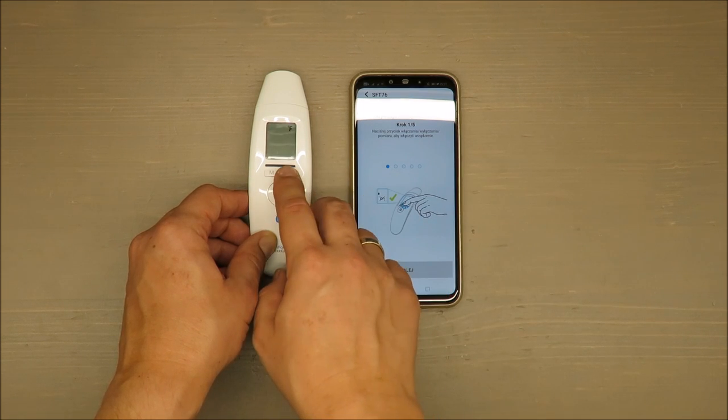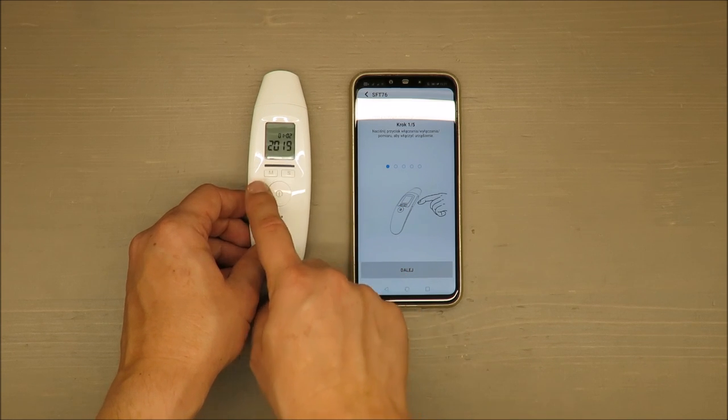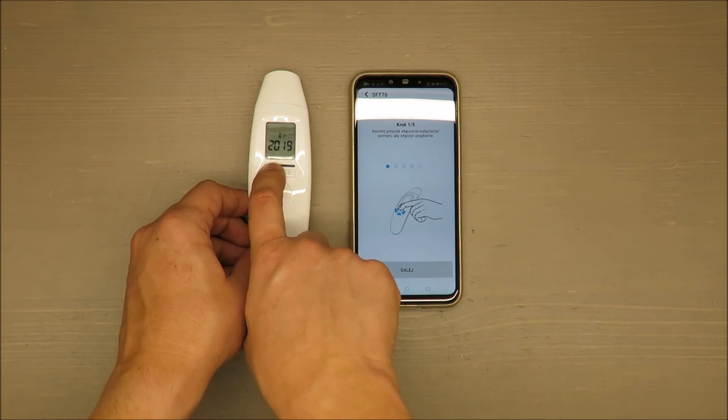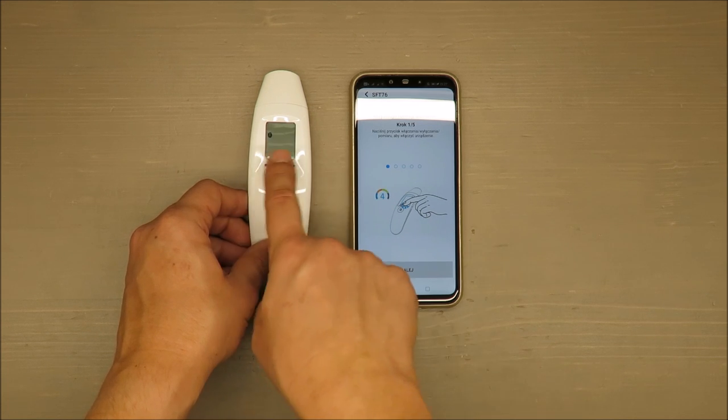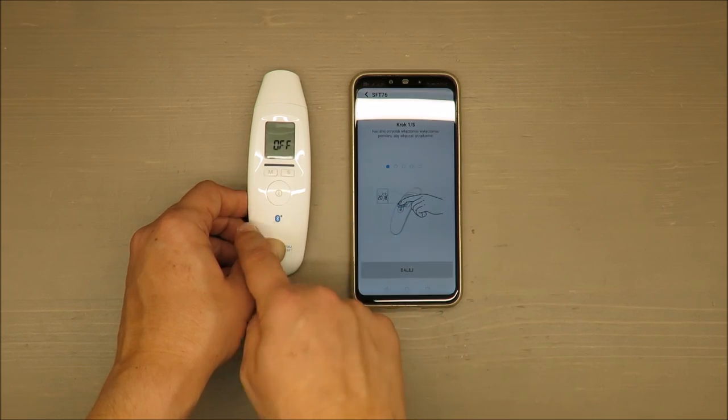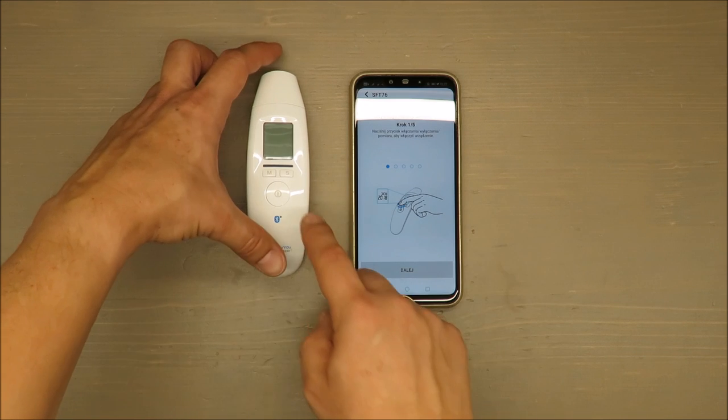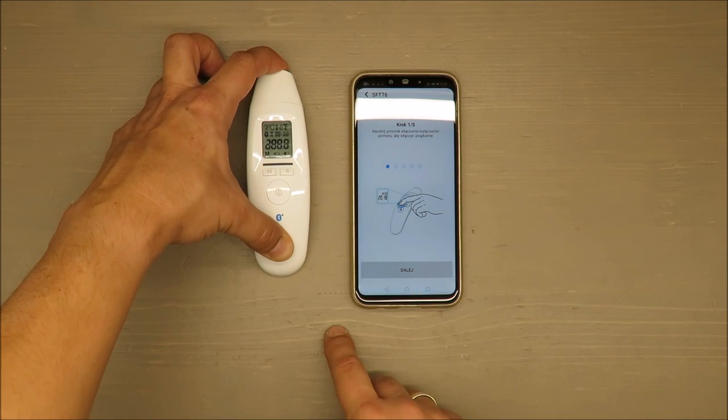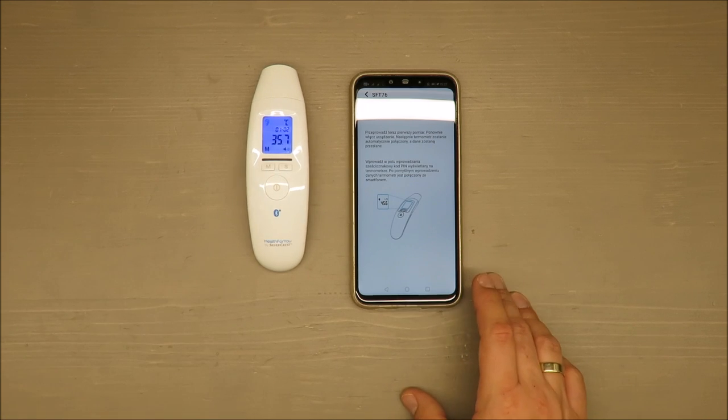Okay, Fahrenheit, no, I want to have Celsius. Next, 24 hours, that's fine. Date and hour, not really important for me at the moment. Bluetooth on/off, on. And now it's turning off.